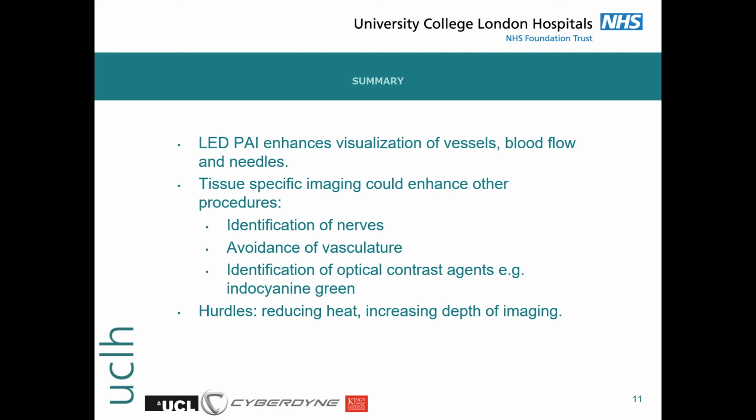LED photoacoustic imaging has the potential to improve vascular access procedures by enhancing visualizations of vessels, blood flow, and needles. We have shown in these experiments how LED photoacoustic imaging can be integrated with clinical ultrasound to add tissue-specific contrast for arterial structures, as well as enhancing the imaging of metallic needles. Further research is needed to identify whether smaller needles and other non-ferrous medical devices like catheters can be usefully enhanced. Similarly, enhancing contrast for venous structures would be particularly valuable.